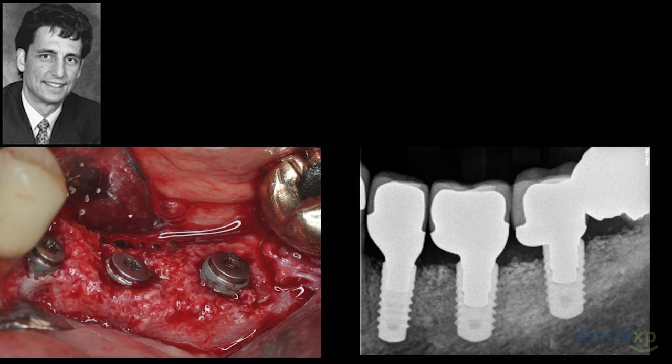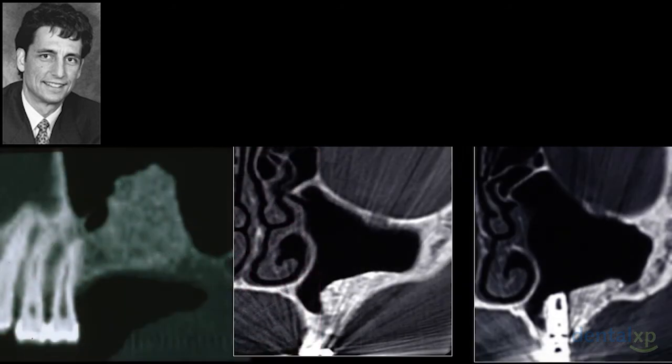We originally had treatment plan extraction of that posterior molar, and that would have given us a little better contours. Unfortunately, the patient decided they did not want to take that tooth out, so our planning wasn't quite where we would have liked, had we known that was ultimately going to be our situation.